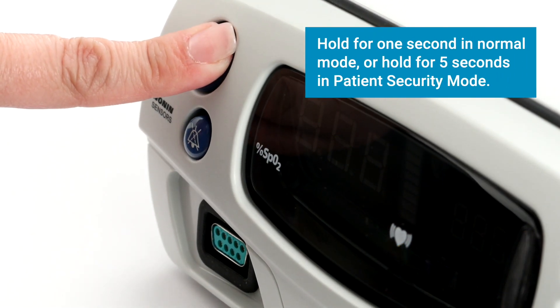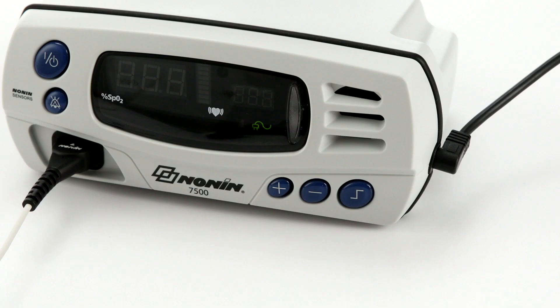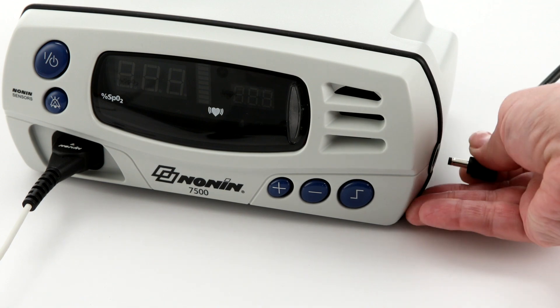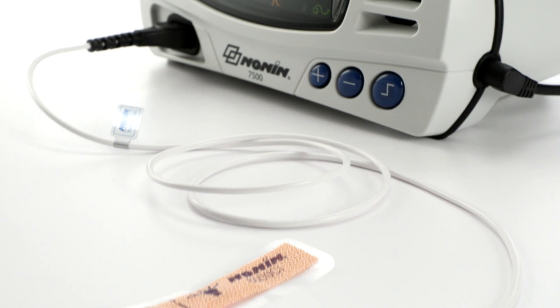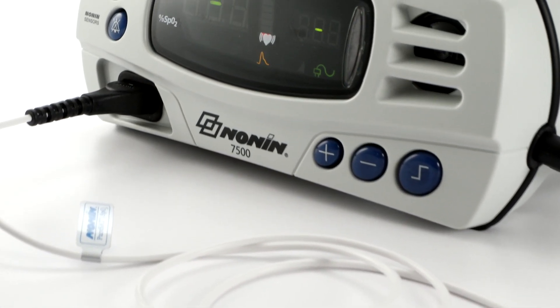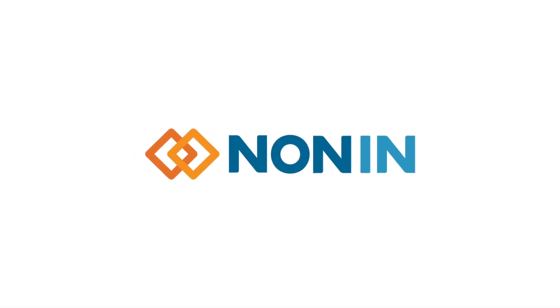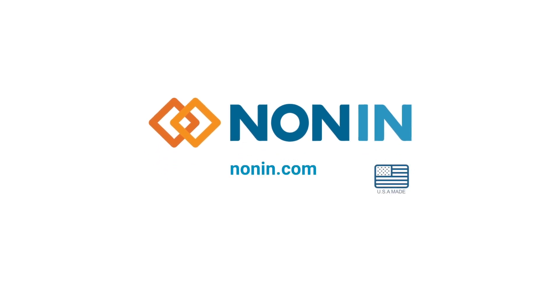Hold for one second in normal function and five seconds if the oximeter is in patient security mode. Then you can unplug and remove the sensor. With proper use, the NANAN 7500 pulse oximeter will provide consistent, accurate oxygen saturation and pulse rate measurement. You can find additional use information on this and other NANAN products at nanan.com.